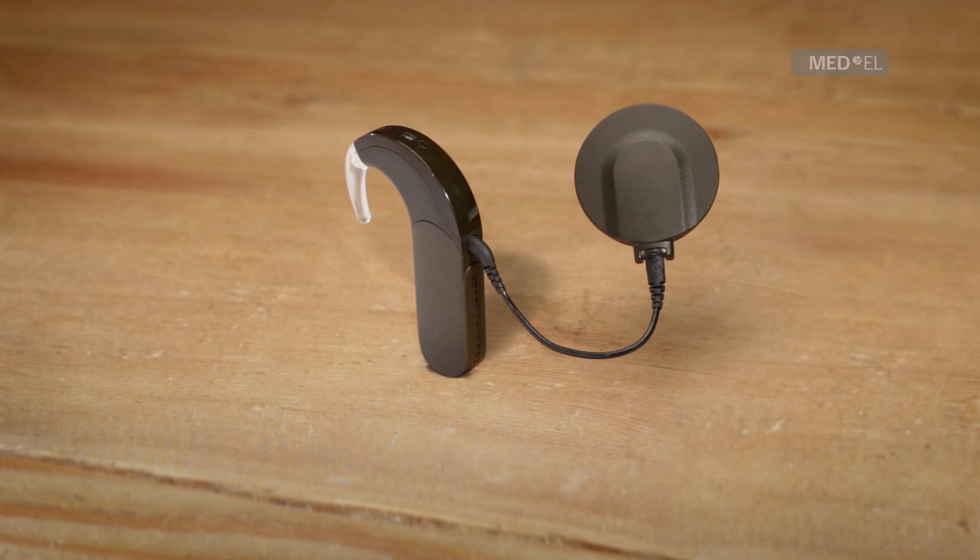DL coil indicator lights. The DL coil features a bi-color LED indicator light. If the DL coil is properly connected to the implant, the indicator lights will appear. Three short green blinks indicate that the DL coil, coil cable, and audio processor are working.